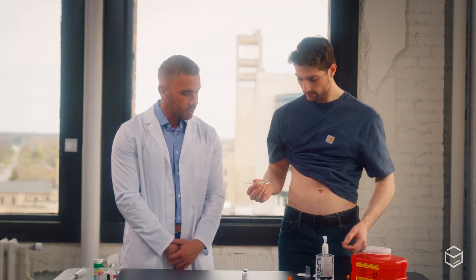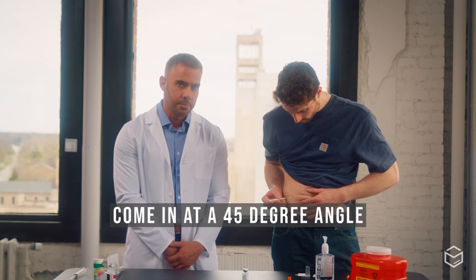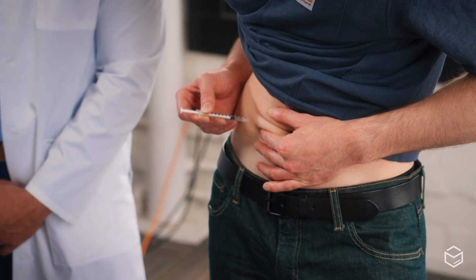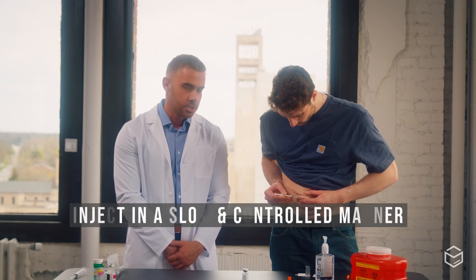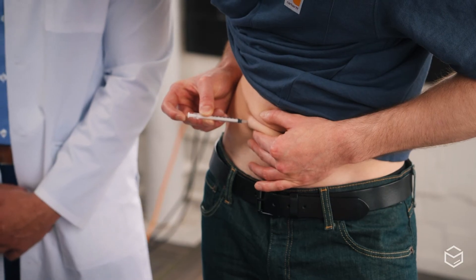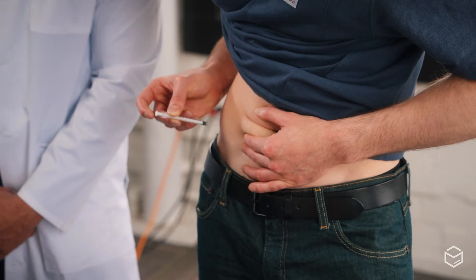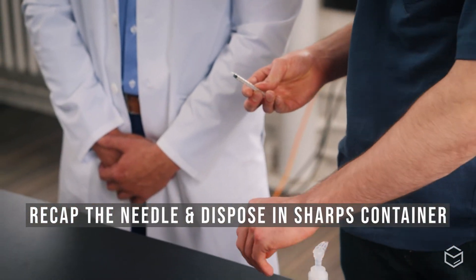Use your left hand to grab a bit of skin and fat, then come in at a 45-degree angle, putting the needle all the way into the skin until the plastic part is touching the skin, and inject in a slow, controlled manner. After all the medication is administered, safely recap the needle and dispose of it properly in a sharps container.